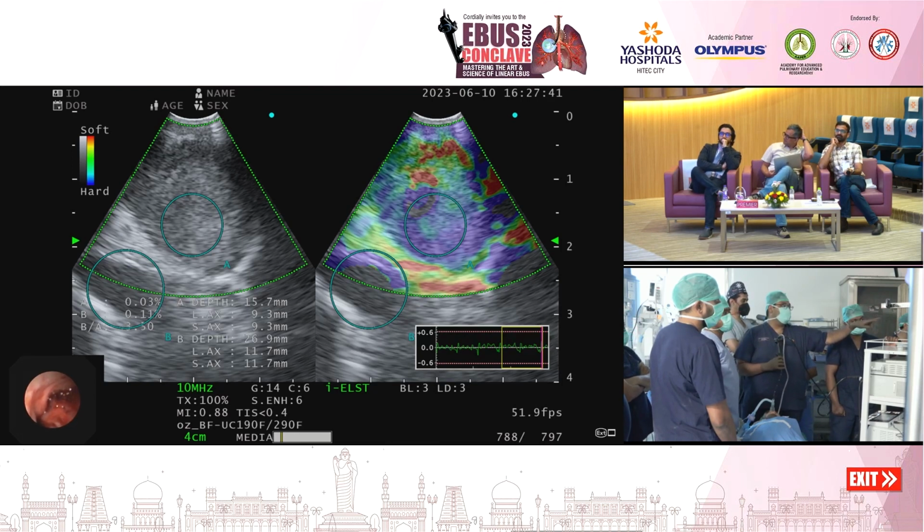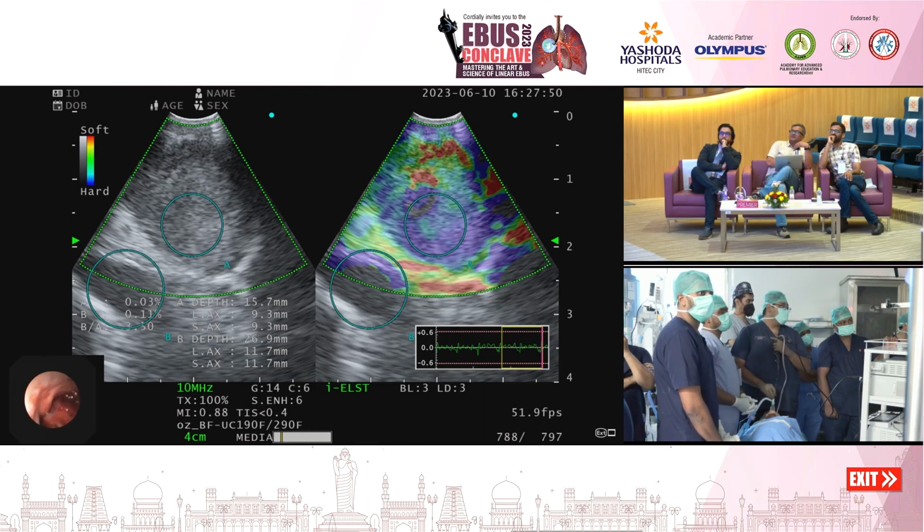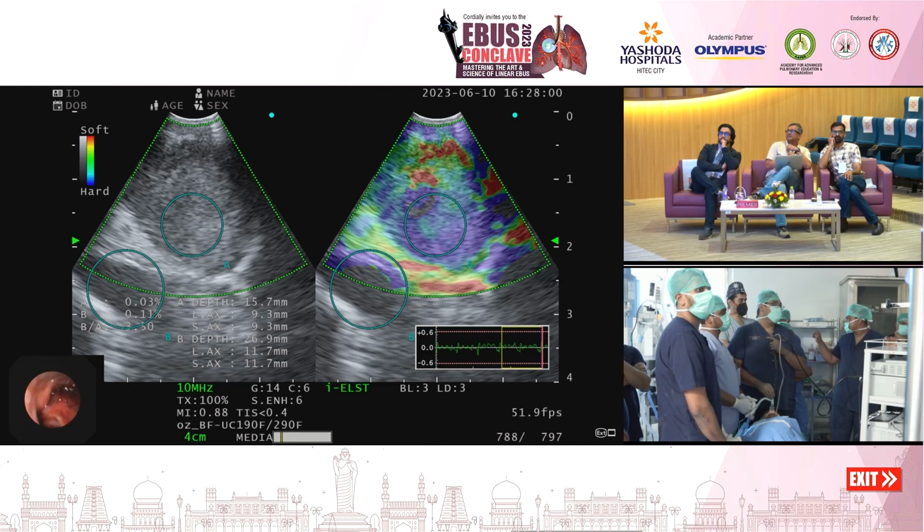The larger circle just cutting through it. So here you can see A, B and B by A, in the bottom corner. A is within the tissue, B is outside the normal tissue. Basically, the higher the ratio, the stiffer the node and the more chance of it being malignant. Generally they say a cutoff of 7 has a sensitivity of about 88% for diagnosing malignant nodes.